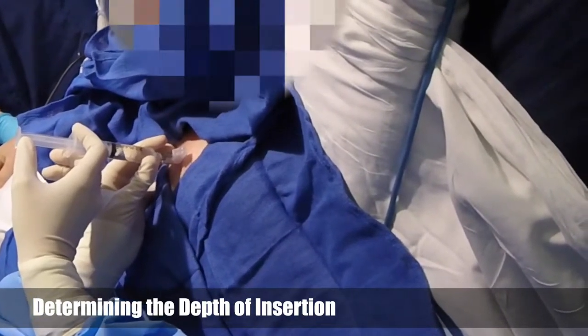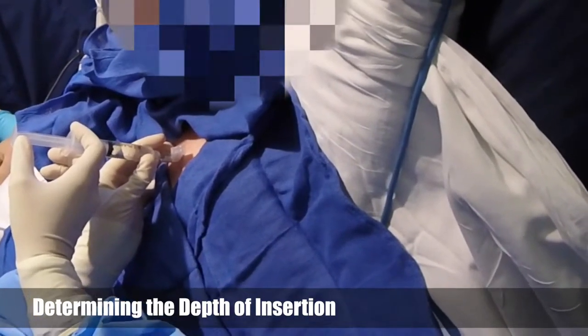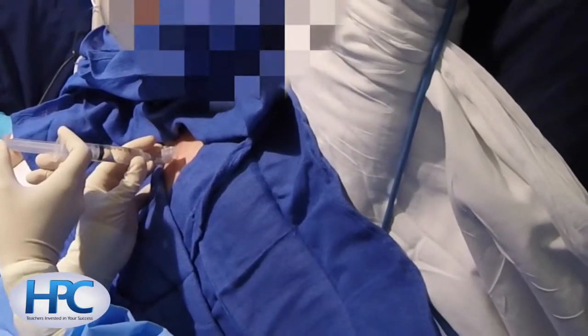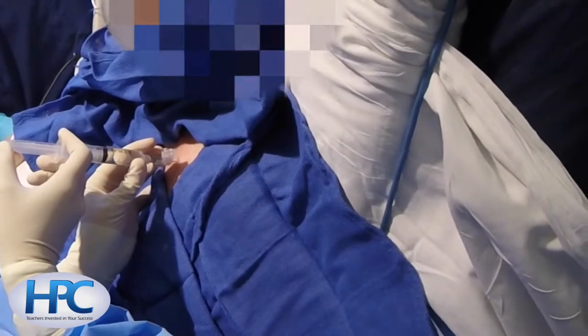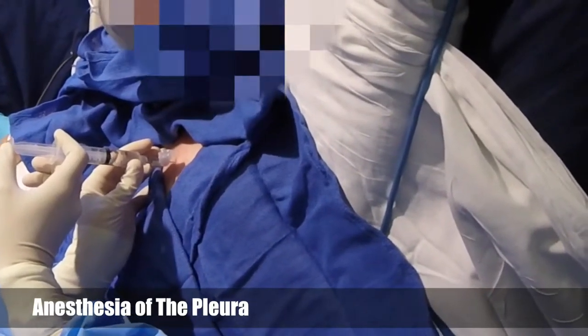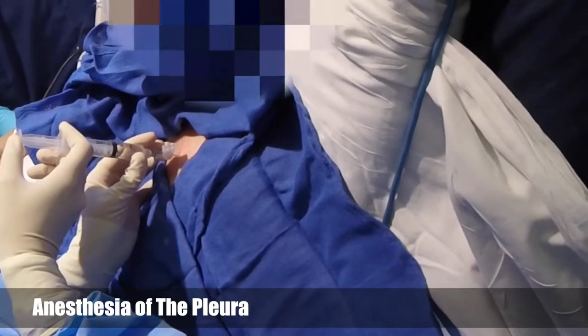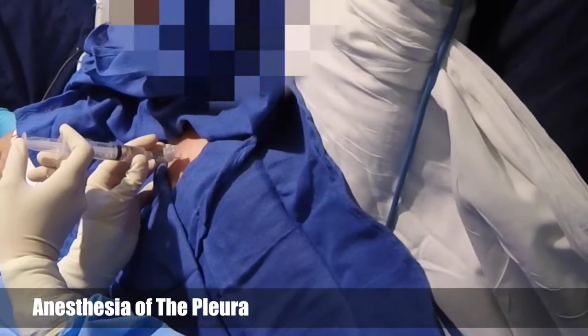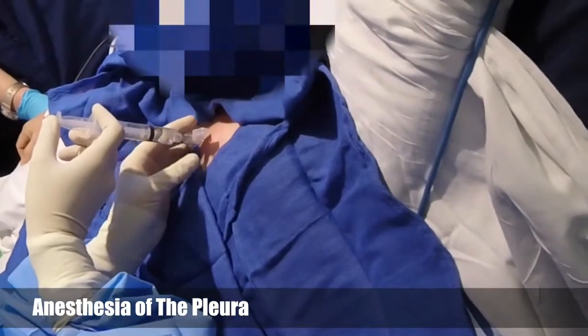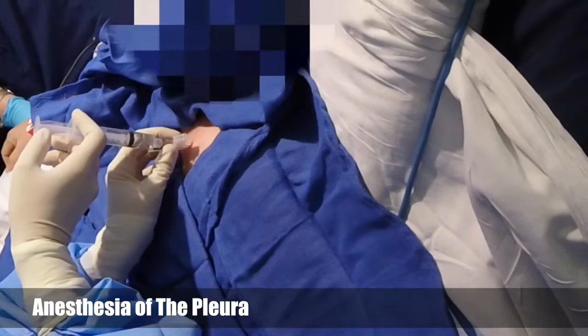Now we see a steady stream of bubbles, therefore we know we are in the pleural space. We then withdraw the needle until we're no longer seeing a steady stream of bubbles. So we're right outside of the pleura. We can then administer a large amount of 1% lidocaine to now numb up the pleura.